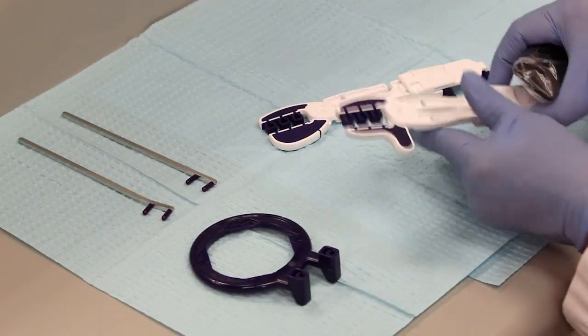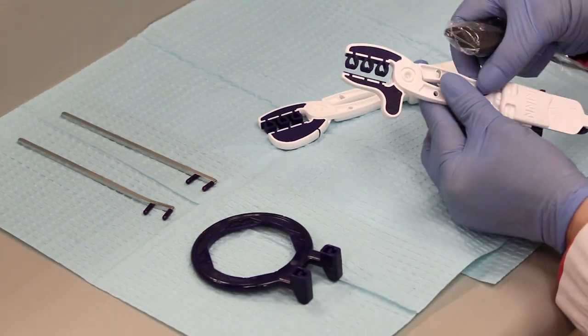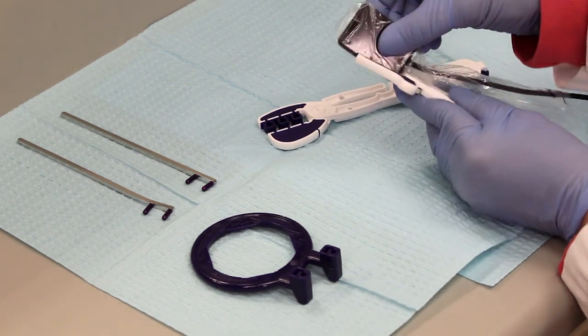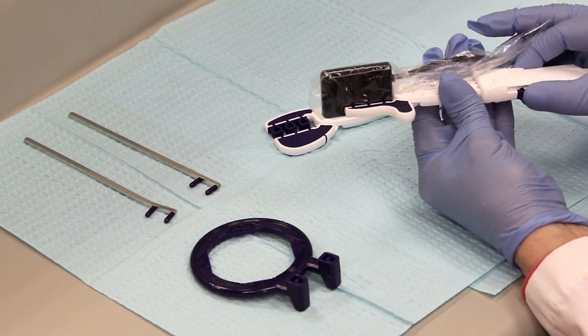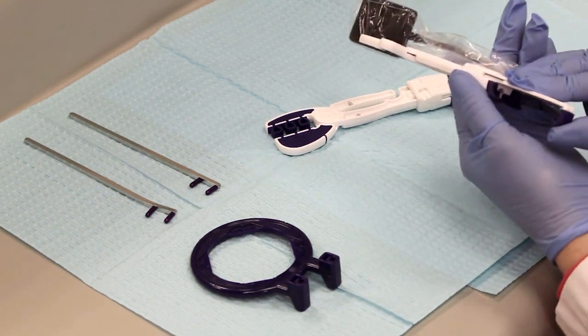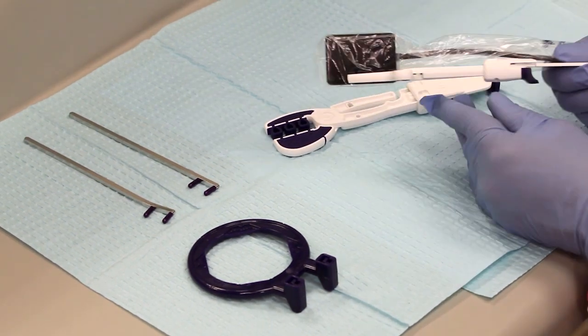Now I'd like to show you how to assemble. Slide the clip down, squeeze the sensor between there, slide the clip back up, and this is ready to go into the mouth.